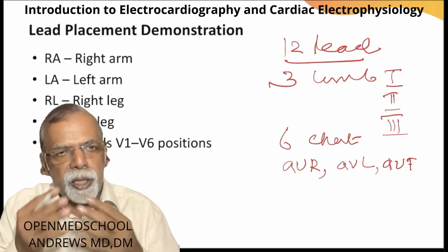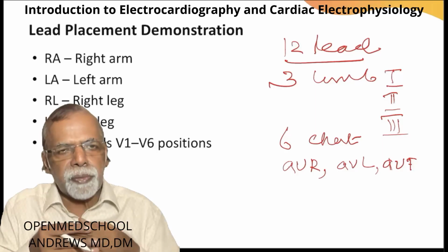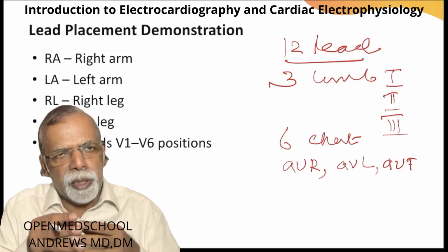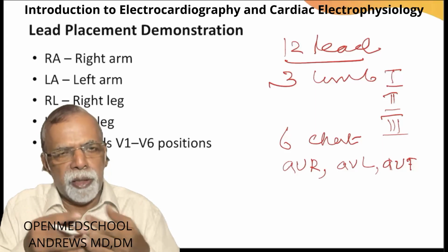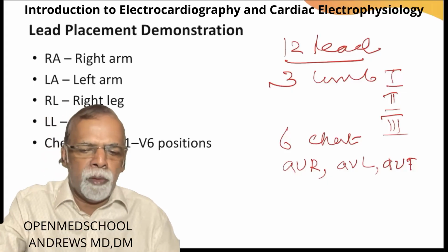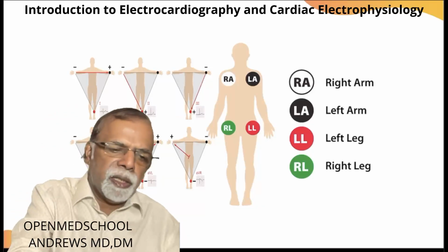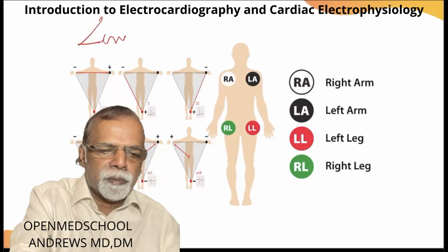If you want, you can have special leads. So then it will be written separately. You can keep the leads in the esophagus. This example is in a special lead, the esophageal leads. So then we take the limb leads.